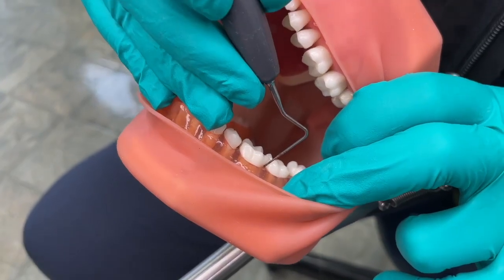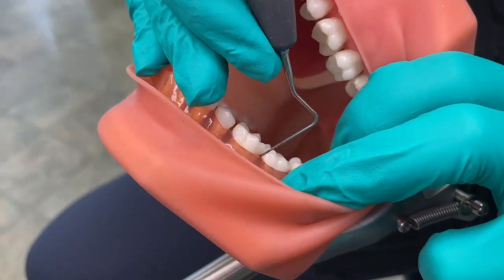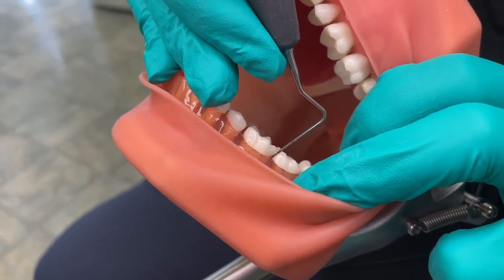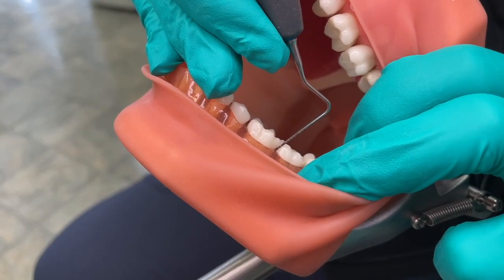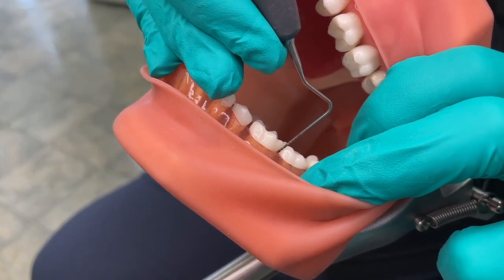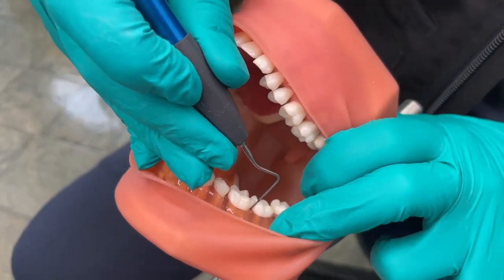So you take your probe down and find that CEJ, which on this tooth is about right here. I'm going to say there's about one millimeter of tissue above the CEJ. So I'm then going to subtract five minus one, and I have four millimeters of clinical attachment loss.